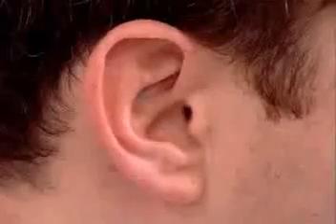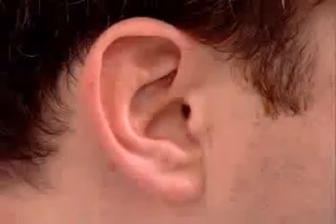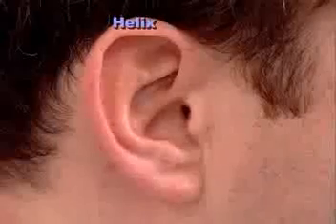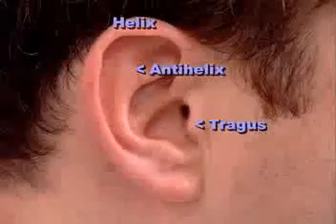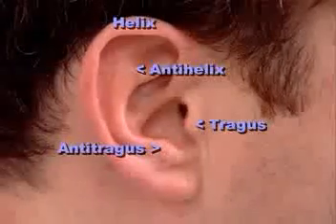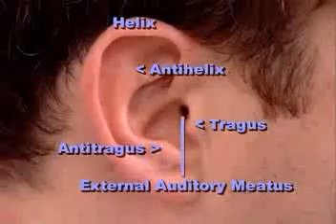The first part of the examination of the ears is inspection of the external ear. One looks at the external ear and notices the helix, the anti-helix, the tragus, the anti-tragus, and the external auditory canal.